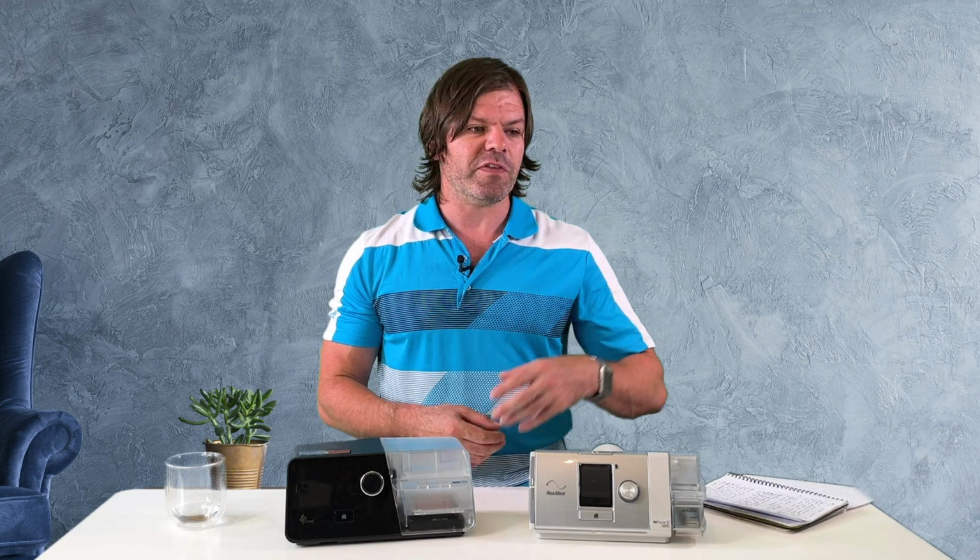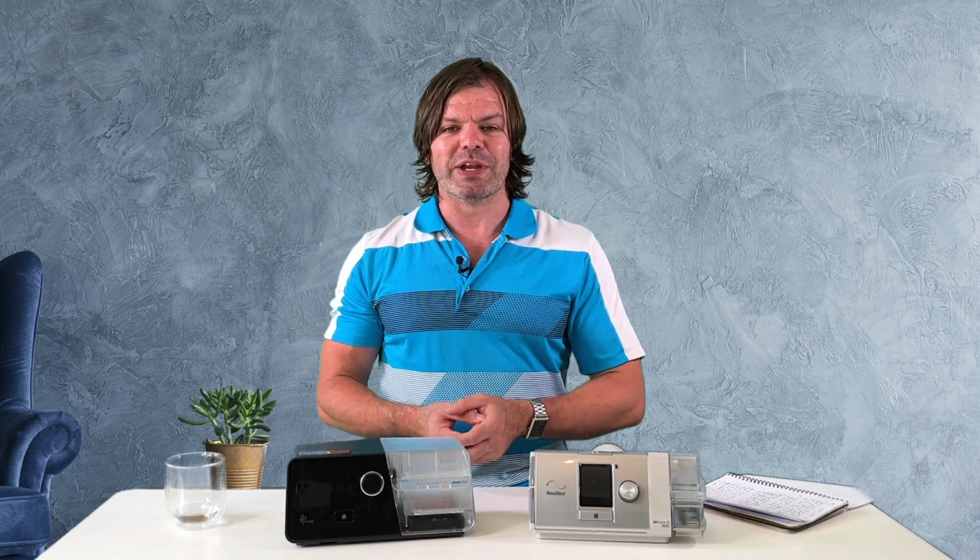I want you to forget about CPAP, okay? Just forget about your fixed pressure machines altogether. You really want to start with your automatic machines, which are going to monitor your breathing and always adjust the therapy levels automatically. So if you've got a cold or you've had a night on the booze or you put on a bit of weight over winter, it doesn't matter. Your automatic machine will monitor your breathing every night, every minute, and adjust accordingly. Of course, you can fine tune it a little bit and watch some of the videos that I do on that. But you want to start with your auto.